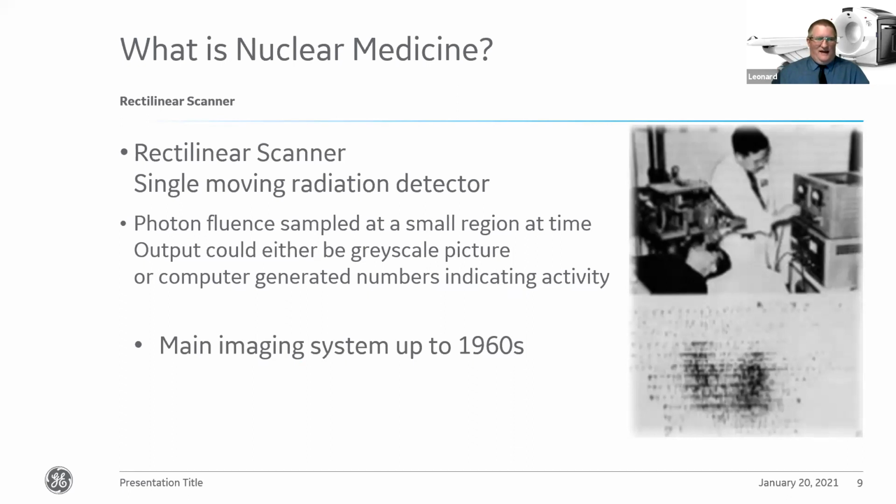I can't get feedback directly as we're going through, but the big thing is, can anybody identify what the image is at the bottom of that slide underneath the photo? This is a rectilinear scanner, and this is what's being imaged on here. If anybody's got any ideas.